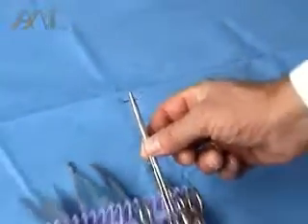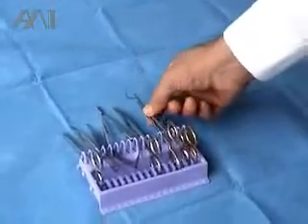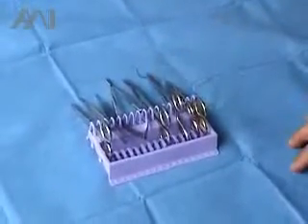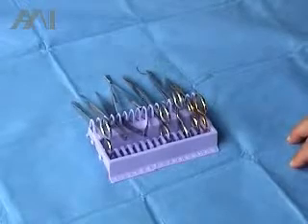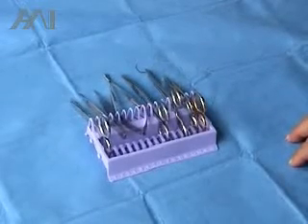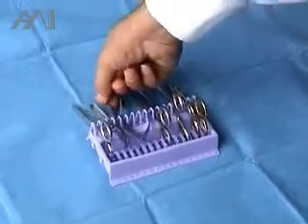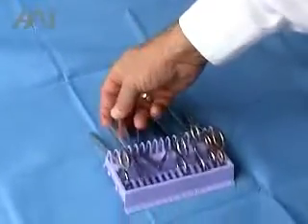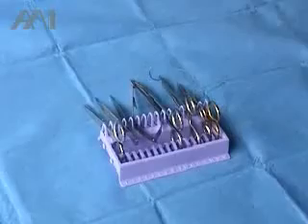Needle holders and needles can be laid with the needle away from the staff to make sure no injury occurs. Even sharp forceps can be laid out with the points away from the practitioner.